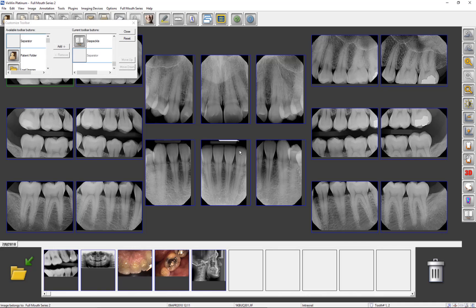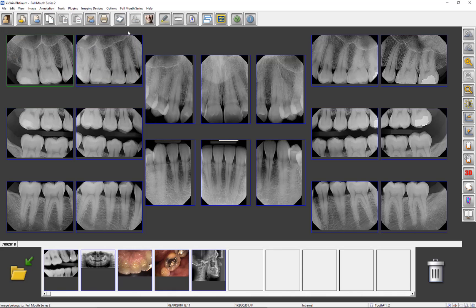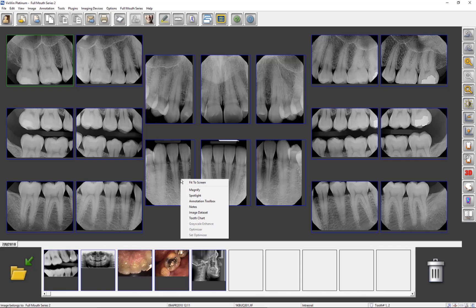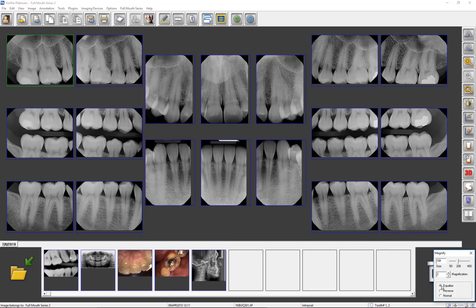By right-clicking on an image, you will have an alternative way of accessing some of the more used image enhancement tools. Spotlight, Grayscale Enhance, and Optimizer reside on the sidebar as well. The new addition is Magnify. To magnify and view an area of the image, choose Magnify and left-click and drag the mouse. In the dialog window, you may change the size of the magnified area and magnification power.